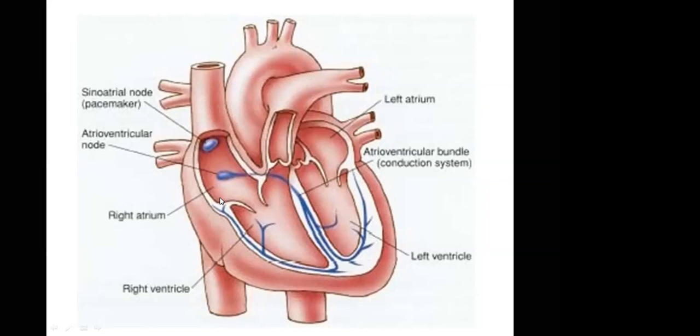And then you connect your catheters to different segments in the atrium. The name depends on the number of catheters you want to use. When we come to the EP lectures, you will see the nature of the catheters, but I want to just use this image to explain some things. One of the catheters can be in the atrium, either the upper part, the proximal atrium, or the distal part of the atrium. And that catheter can be in the triangle of Koch, which contains the AV node. Then another catheter can be directly on the His bundle.